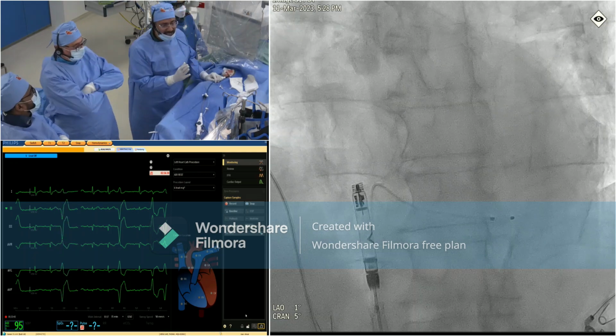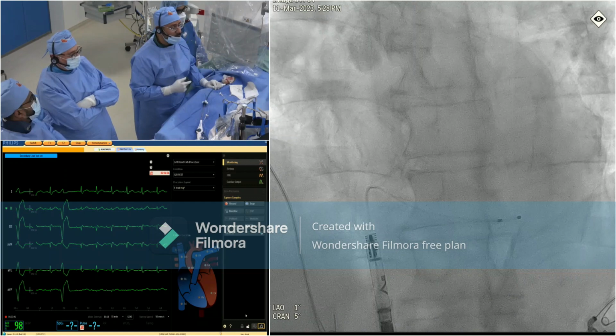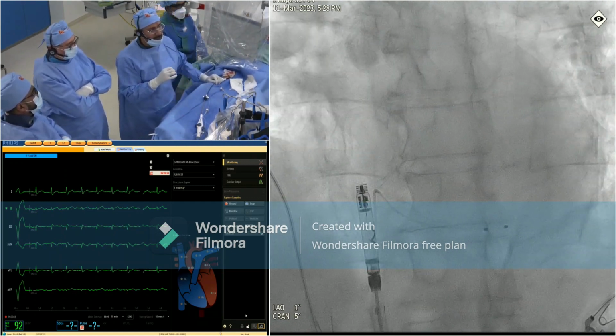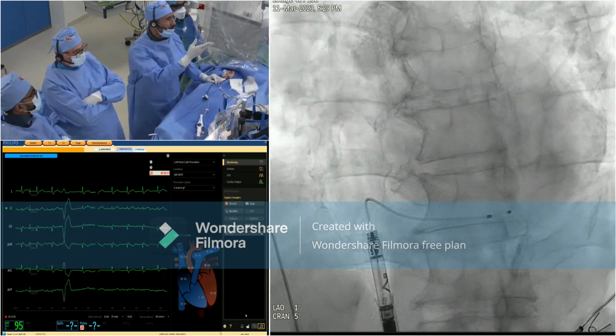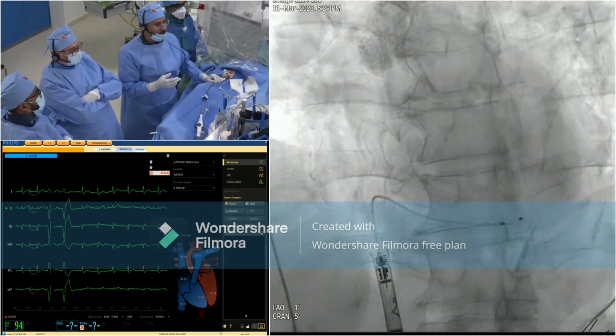Then you have to cross the tricuspid valve, which is quite challenging here when you can see the position of the temporary wire. You have a feeling like a road map. It's not going to be an easy procedure, because you have a dipping across the tricuspid valve. Again, you can see the RCA. It's like a metallic jacket drawn in front of you.